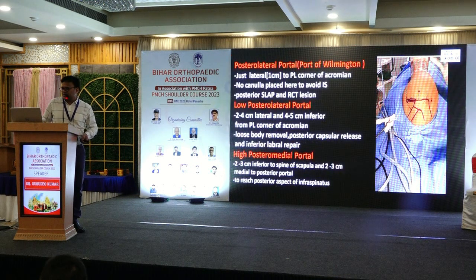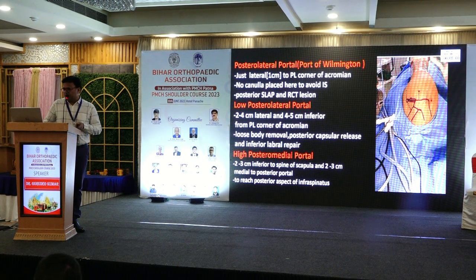Then the posterolateral portal, or port of Wilmington, is just lateral or anterior, 1 centimeter to the posterolateral corner of the acromion. No cannula is placed here because it leads to iatrogenic injury to the infraspinatus muscle, and it helps to address the posterior SLAP and rotator cuff lesion.